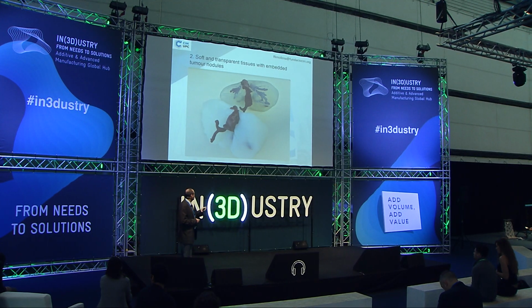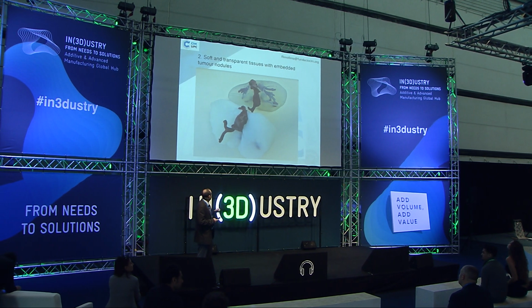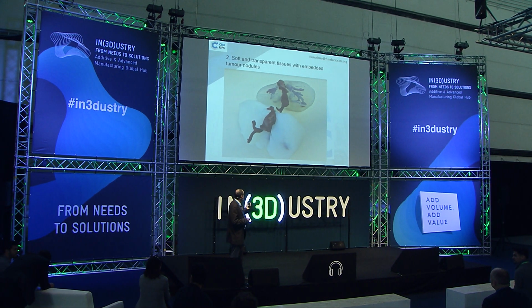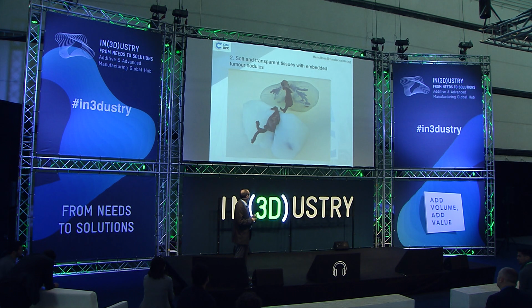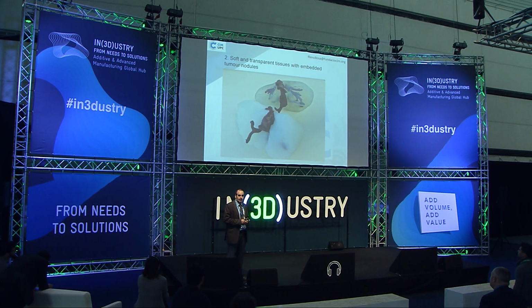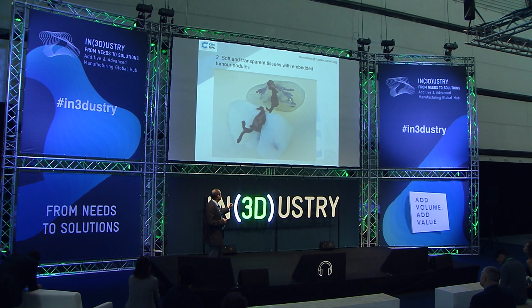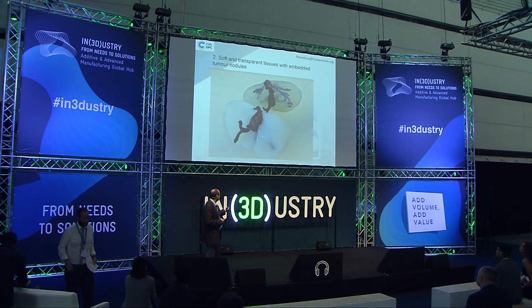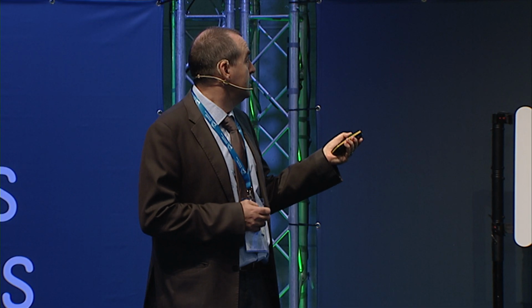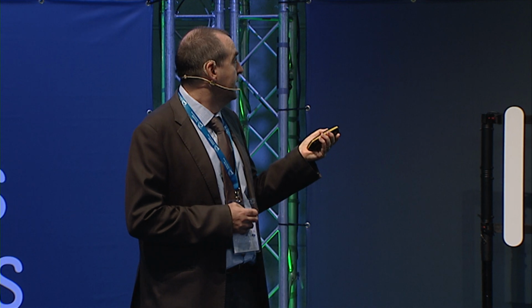Another very interesting thing, you are going to see those prototypes on the spot there. It's about soft tissues. And in these soft tissues, there are vessels and there are tumor nodules inside. They are soft, and this, for example, is more transparent but a little rigid, and this is very soft. It's silicone, okay? And the surgeon is going to plan the surgery here.